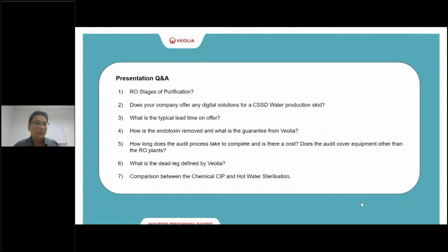To me, hot water sterilization is considered a continuous sanitization, which is a continuously hostile condition to prevent biofilm formation. Hot water sterilization is very powerful to kill the naked pioneer cells, so the cells don't survive long enough to plant and grow within the main ring itself.